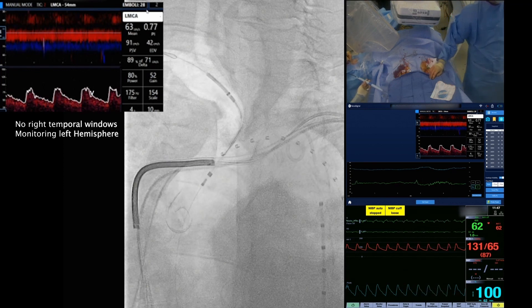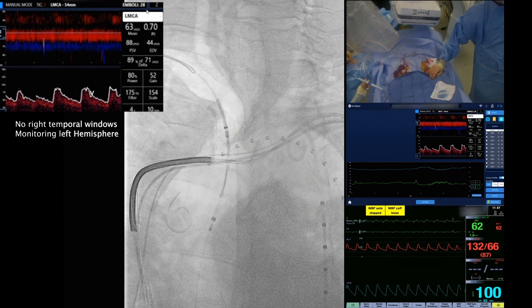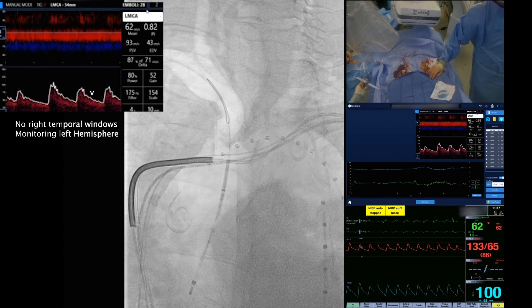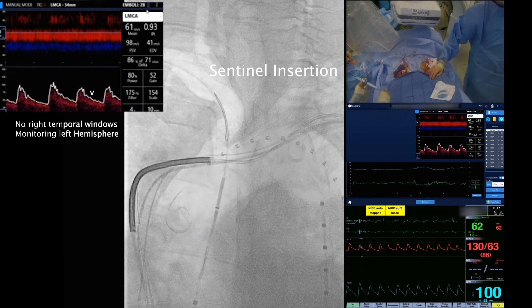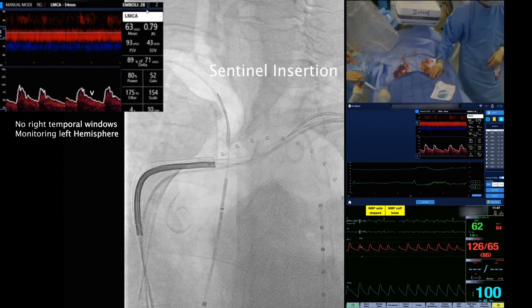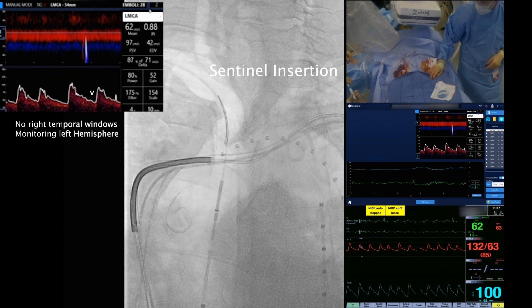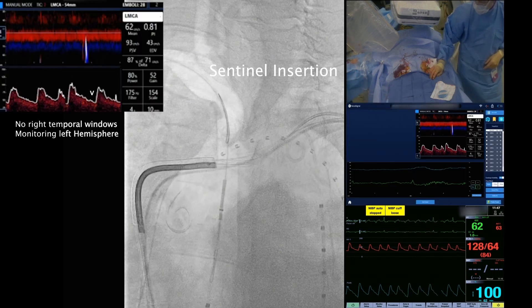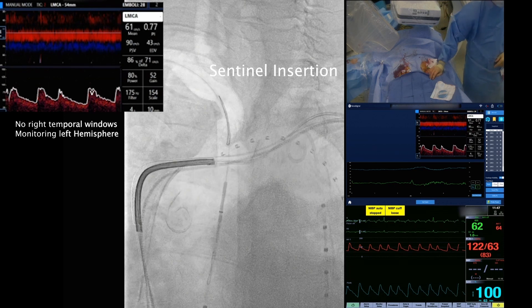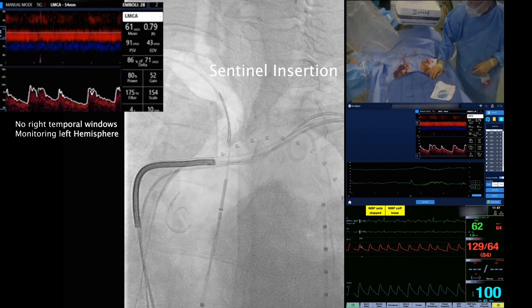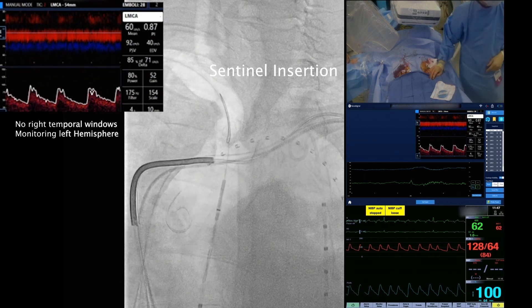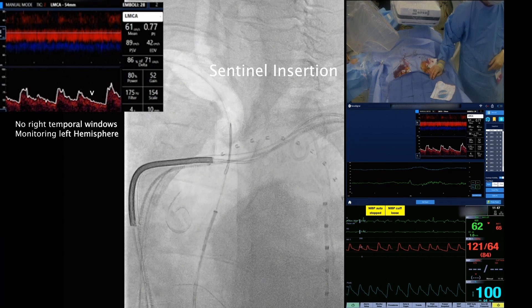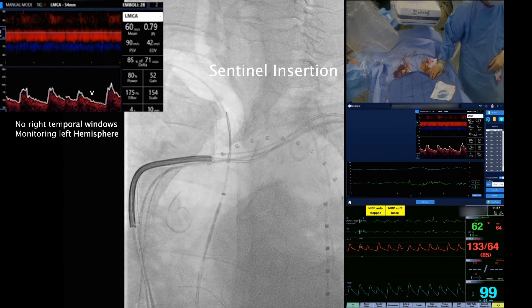The Sentinel device is inserted over the guidewire into the ascending aorta, and then deployment of the proximal filter is performed 1-2 cm above the ostium of the right brachiocephalic artery. This can be achieved by sliding the first knob backwards.